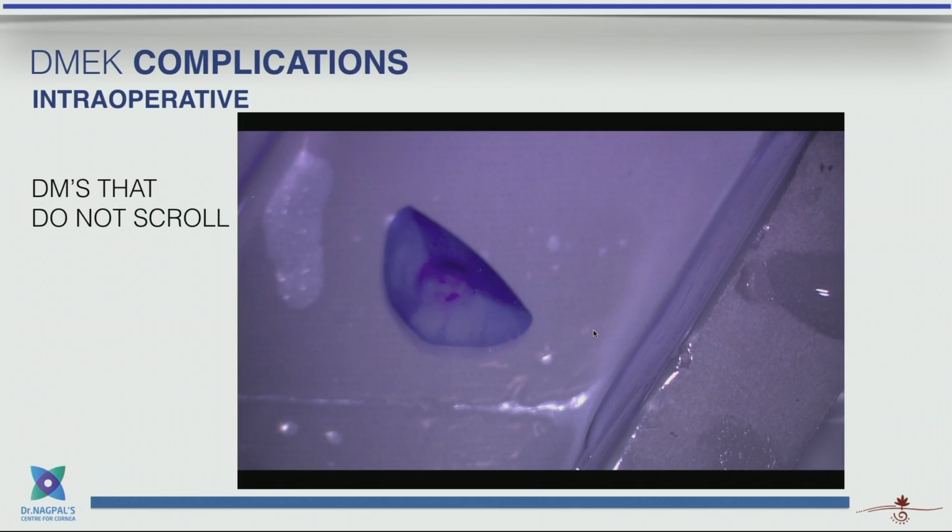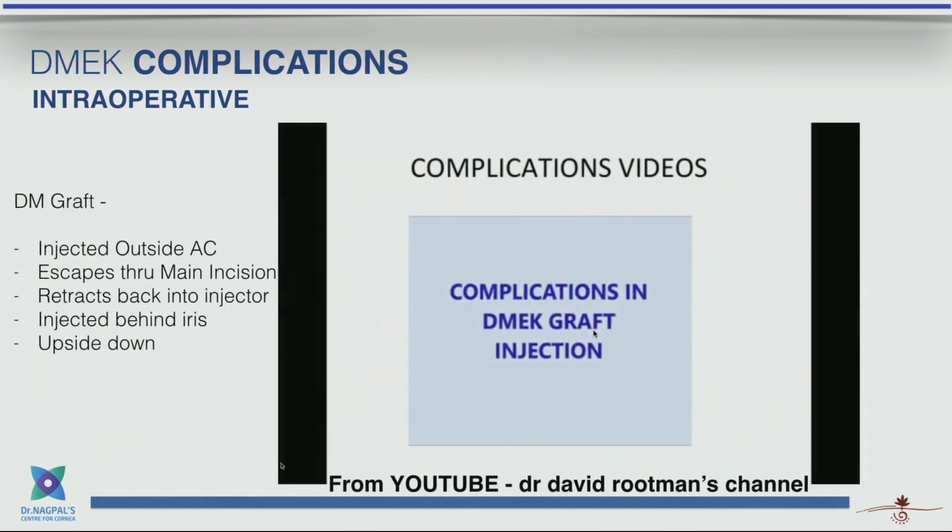And at this point, I would like to add, I got a tip. I had asked this to Siddharthan once a long time back, and he had suggested, I don't know whether he still does it, that you should just shake it, put some saline, push it in, and then when it is moving around, you can quickly take it inside when it is in a sort of partial scroll, before it starts opening up again. But it's a quick thing that you need to do in a very quick way. So that's one of the things.